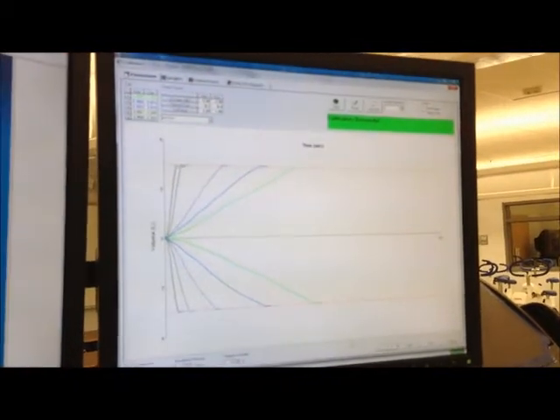Here you can see the green notification: calibration successful. Make sure all of these values are still the same, then click OK. And that is how you do flow meter calibration.